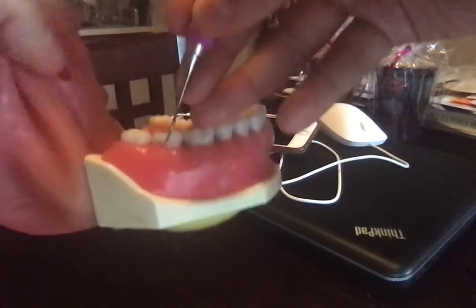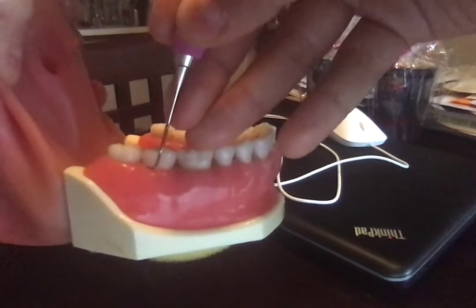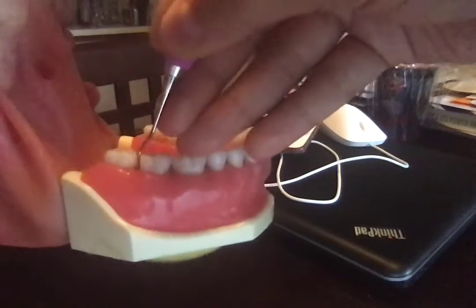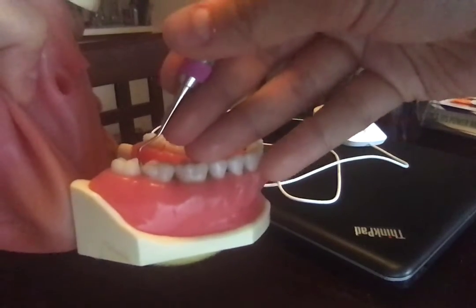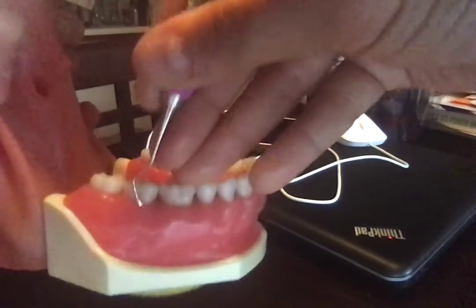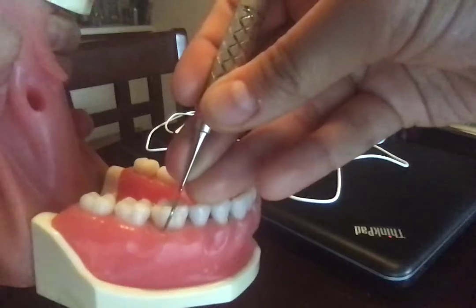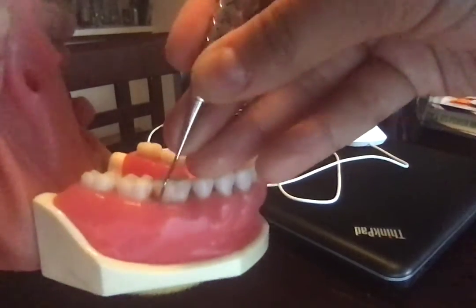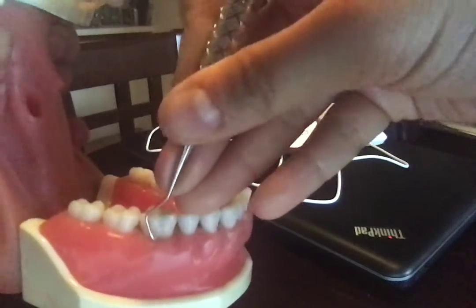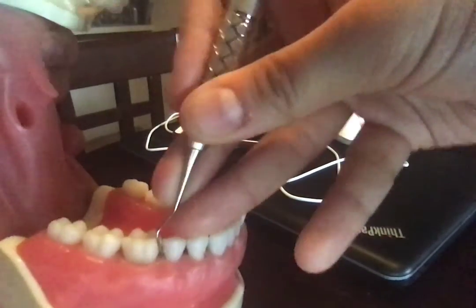Once again start at the distal line angle. Insert subgingivally — insert closed, open, and pivot a little so you are making sure you're using the toe third of the working end, and then rock and roll. Turn your instrument to go mesially — insert, close, open, and do the same. Insert, close, open, until you are interproximal. Make sure your fulcrum does not get lazy.